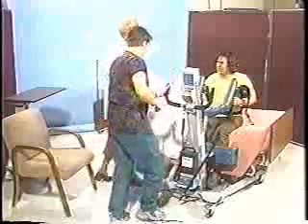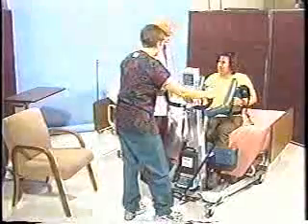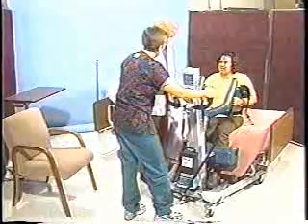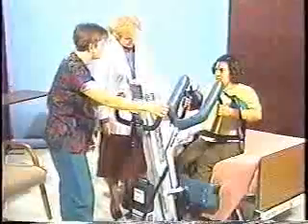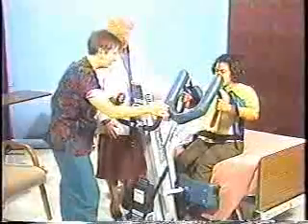The first caregiver stands near the control panel while the second caregiver remains close to the patient. Using the control, raise the patient by pressing the up button. Continue to raise until the patient clears the bed.